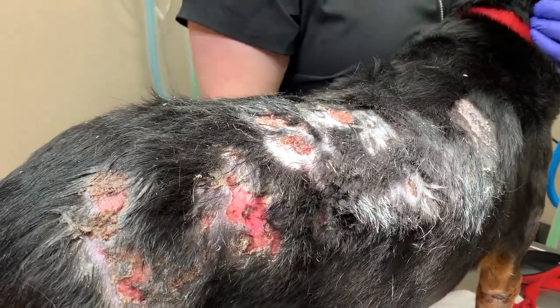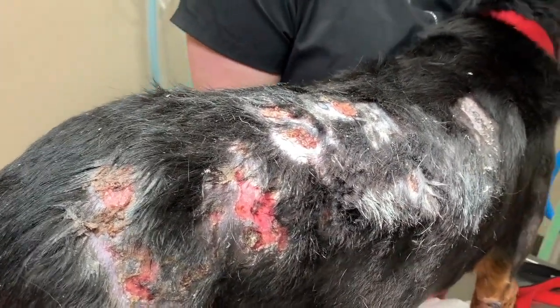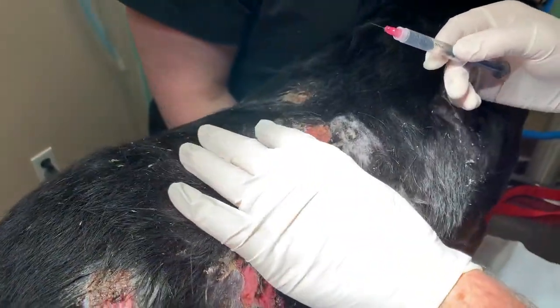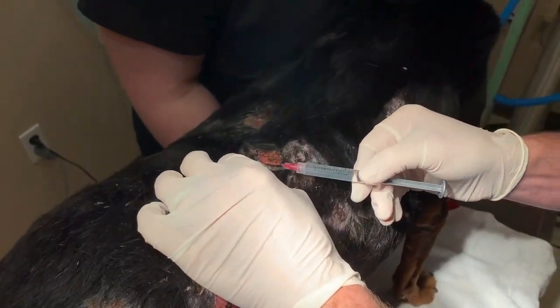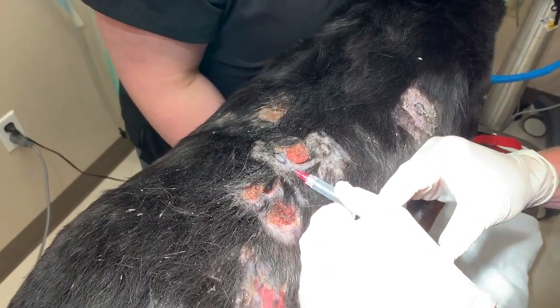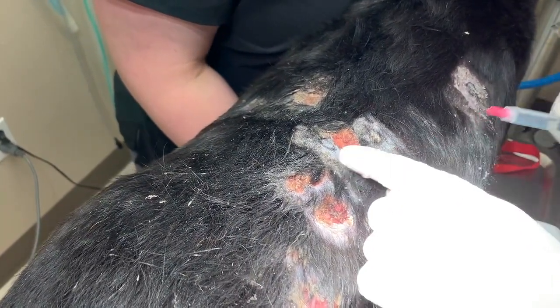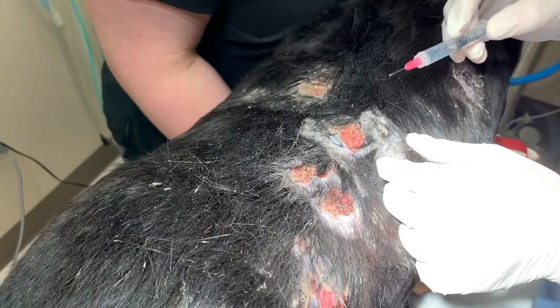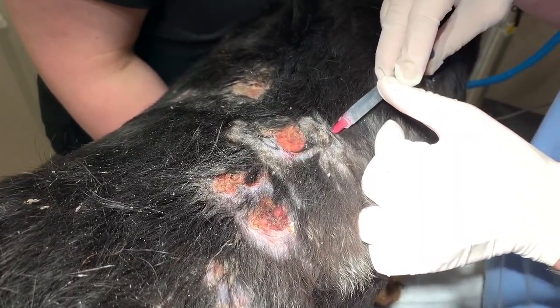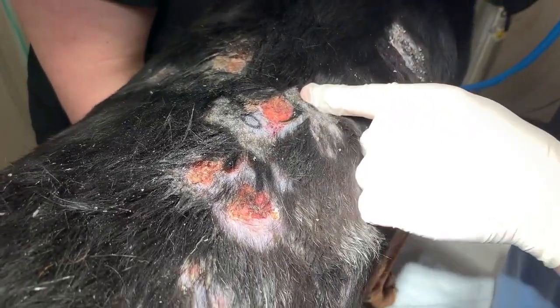I'm going to cap the needle, then come in from the side a little bit, go underneath our location, and just distribute the lidocaine — about one milliliter under each biopsy site. Draw back first, redirect a couple of times. It stings a little bit.